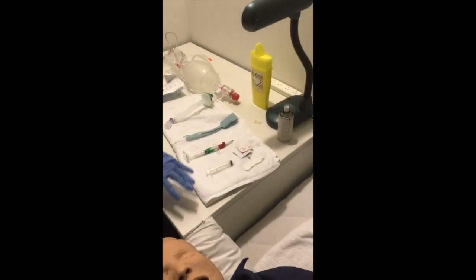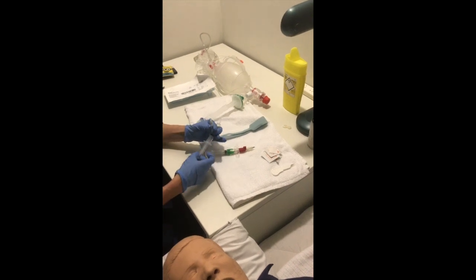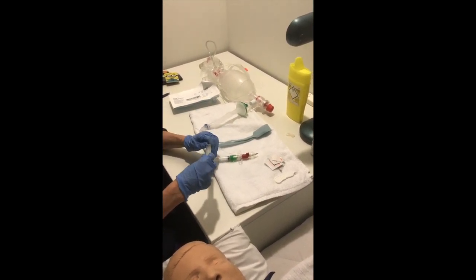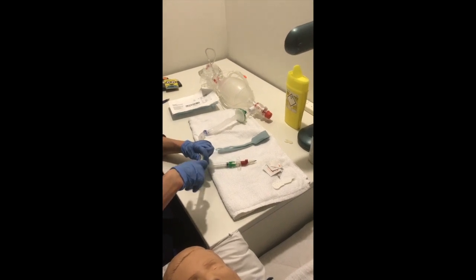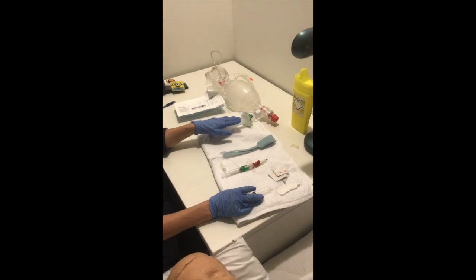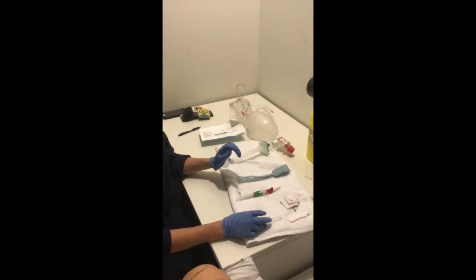You have a scalpel, we have our device here. We would have already checked that our cuff inflates, and then we would fully deflate this prior to commencing. We have our foam tie here that will help secure it, and we have our BVM with our appropriate adjuncts and a sharps container as well.